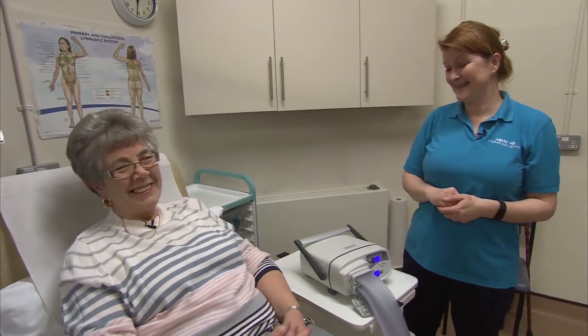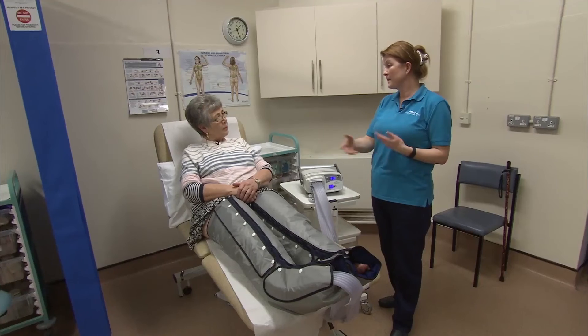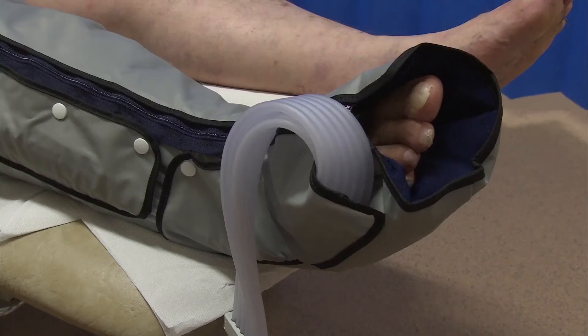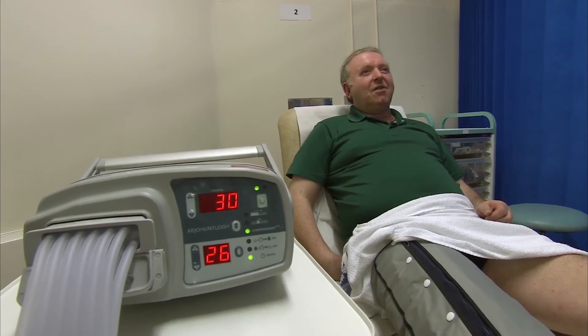My husband isn't very well, and sometimes I've got to leave him in bed while I come, so having the machine at home will be really good — handy for me anyway. It's important that you discuss buying a machine with your lymphedema therapist and try them in the clinic first to see if they do help you.